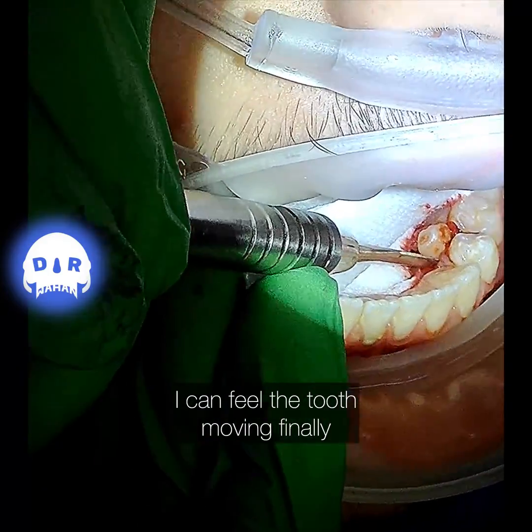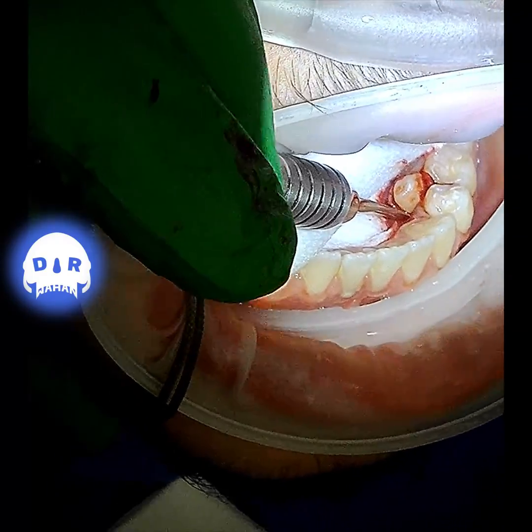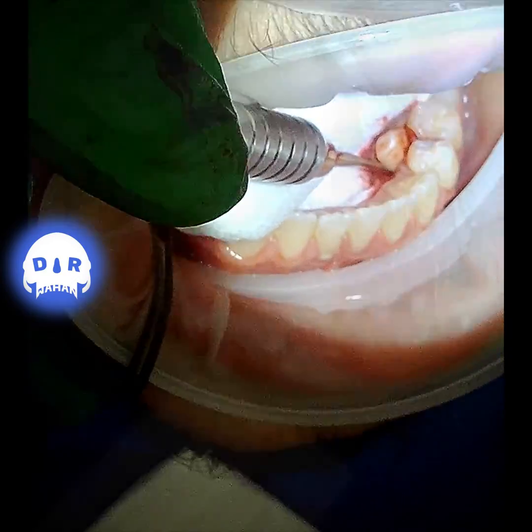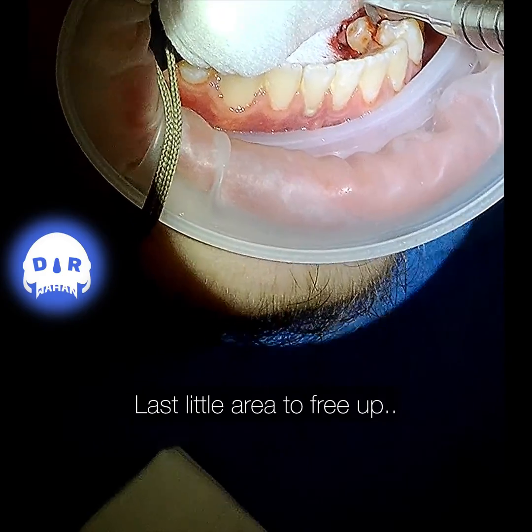As I mallet, you can hear the change in pitch, indicating that the periotome is getting where it needs to be — between the root and the surrounding area.